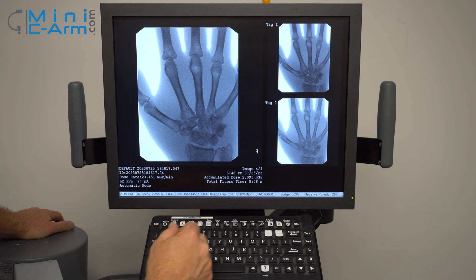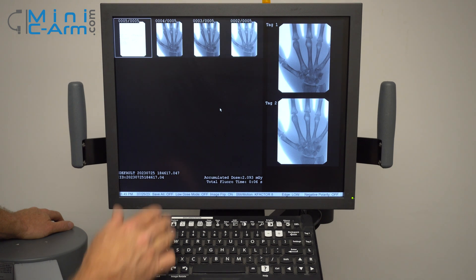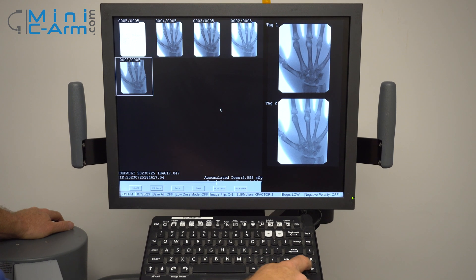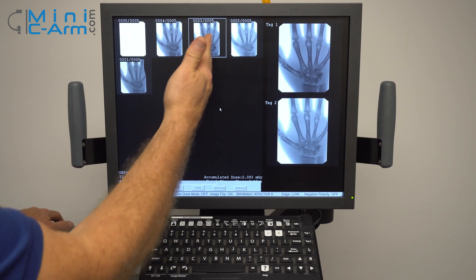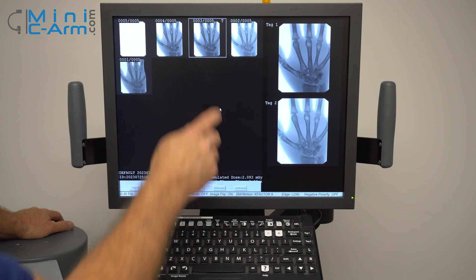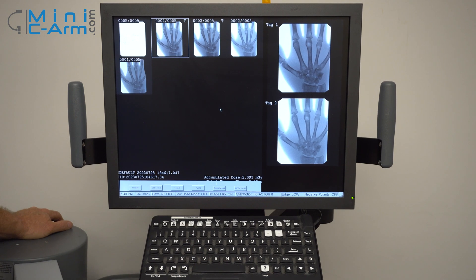When you're finished with the case, you want to press case review. Here you can save specific images by using the arrows to navigate through. If you want to save an image, press the space bar so it says tagged. You can tag multiple images and then come down here and click save all, and they're saved.